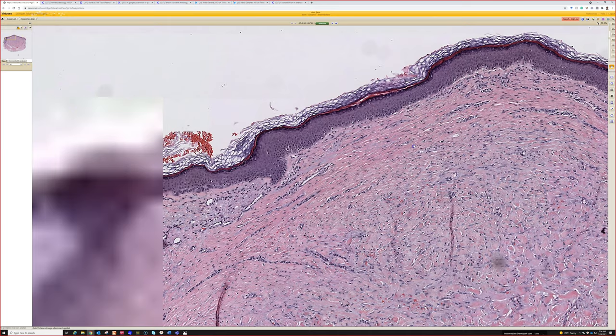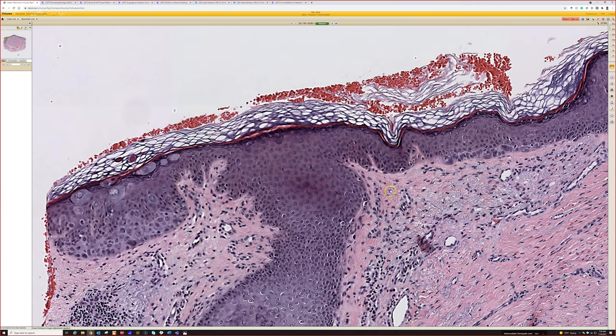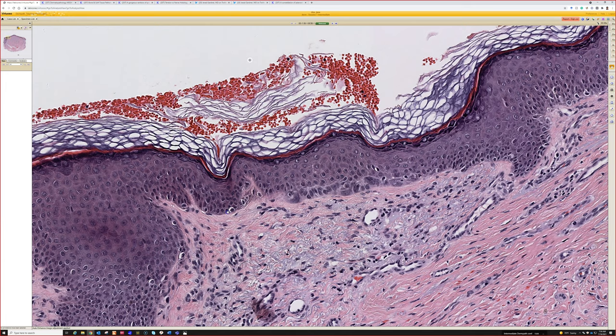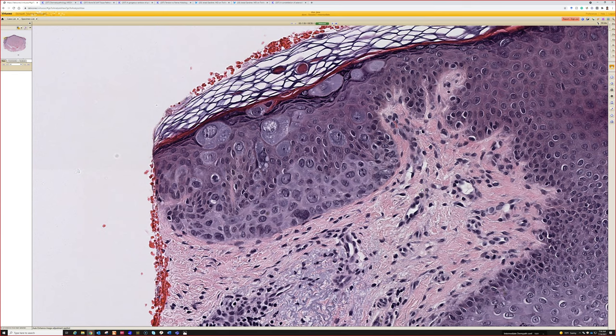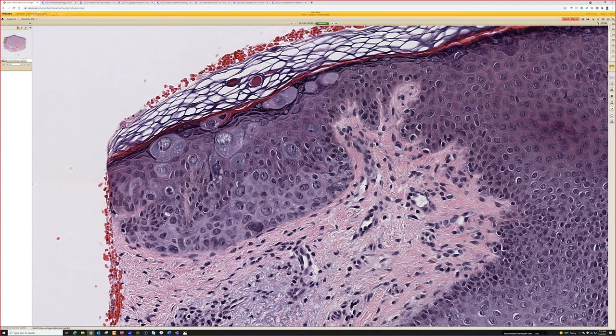Interestingly, over here we've got some atypical cells along the base that seem a little more ugly than the regular AK. And over here — yeah, it looks like EDV, epidermodysplasia verruciformis. Although this one has more atypical-looking keratinocyte nuclei than the average case. I've seen squamous cell carcinoma arising in a background of EDV with EDV-like features but clearly ugly. When cells have HPV cytopathic effect, their nuclei get large, making it harder to assess whether that's malignant atypia or just cytopathic change from HPV.